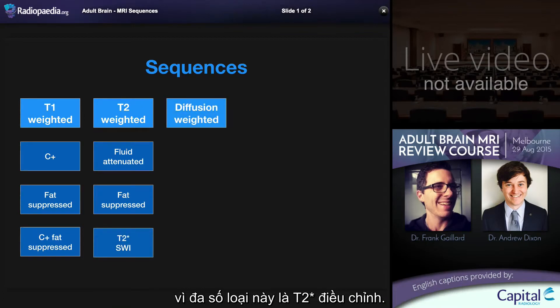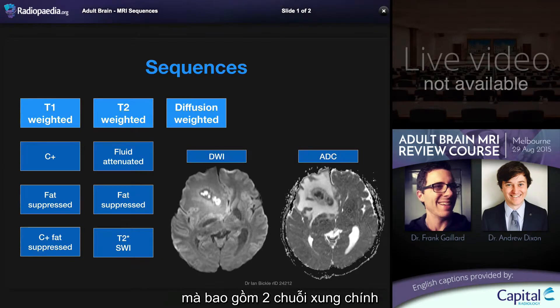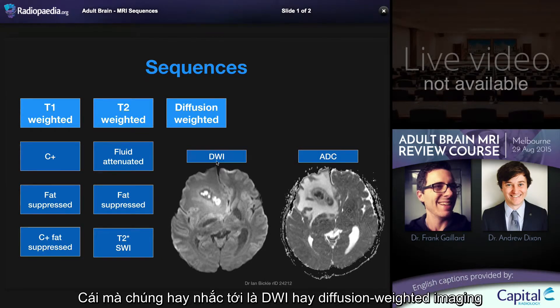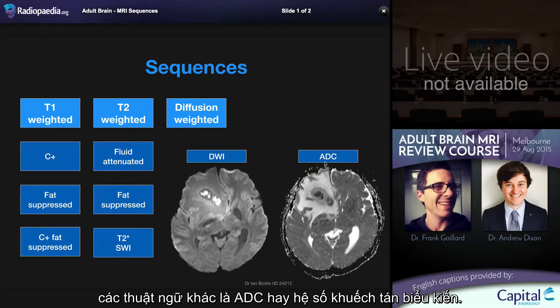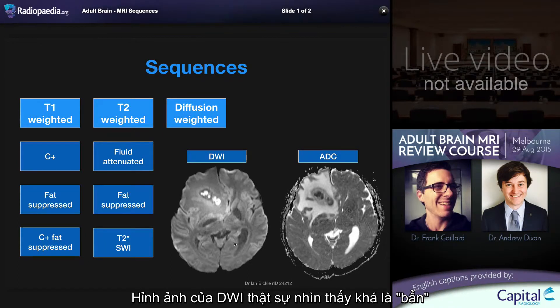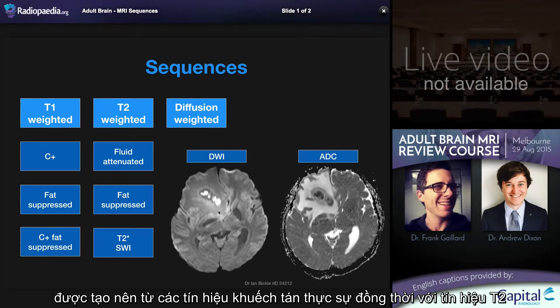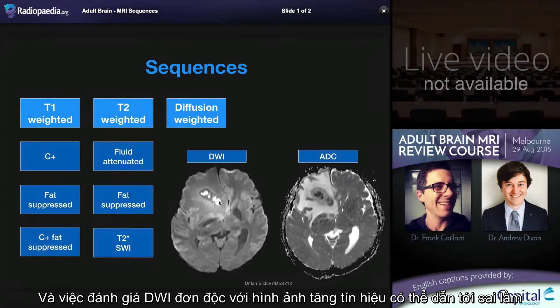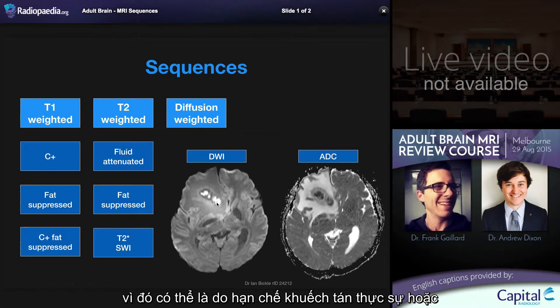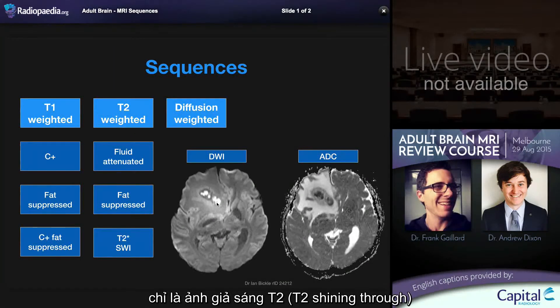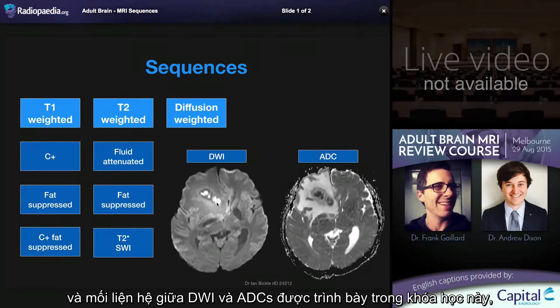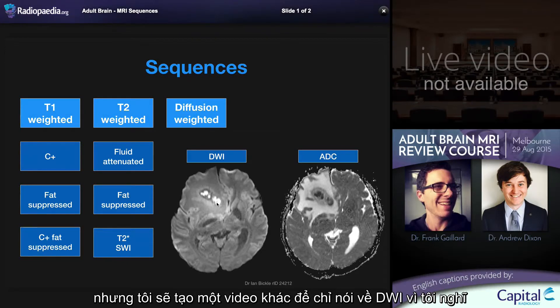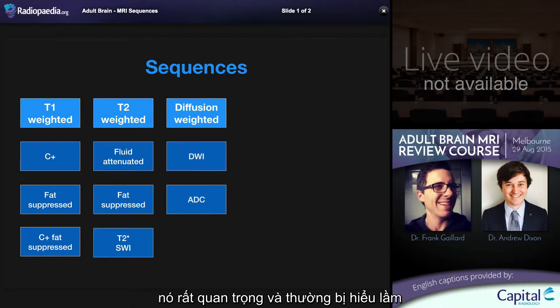The next column is diffusion weighted imaging, which encompasses two main sequences: what we commonly refer to as DWI — diffusion weighted imaging or isotropic imaging — and ADC, or apparent diffusion coefficient. The DWI sequence is really quite a dirty sequence made up of both true diffusion information and T2 information. Examining the DWI on its own can lead you to erroneously interpret high signal as representing true abnormal restricted diffusion, when in fact what you're seeing is so-called T2 shine-through. I will be creating a separate talk to examine DWI because it is a very important and often misunderstood sequence.